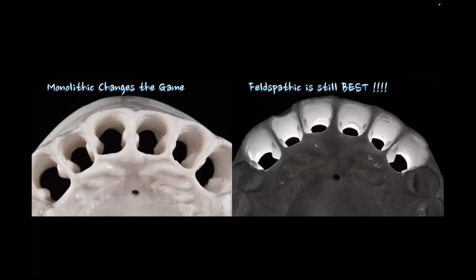And I'm like, but you have 8 teeth there. And some of them are out further, some of them are in further, some of them have different prep shades. How is it possible you can use one ingot? Because one ingot at different thicknesses is going to do 8 different things. So I wanted to throw that in there, as we're in such more of a monolithic world these days than ever before. I wanted to make sure that you're thinking through both sides of the materials.